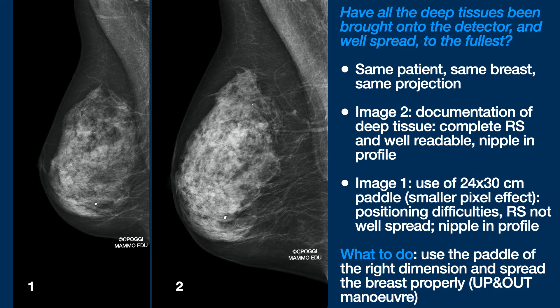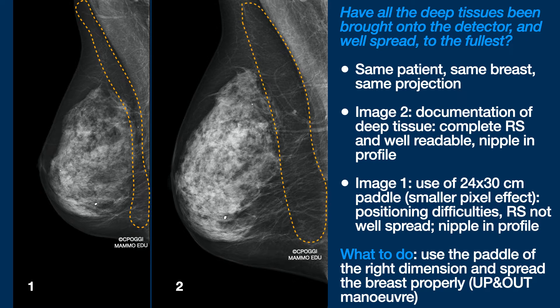Same patient, same projection. In both cases the retromammary space has been documented to the full. In the first one, however, using the larger paddle has created some trouble in positioning and in spreading of the deep tissue, which is not sufficient. There is a difference in size of the two breasts, due to the smaller pixel effect induced by the use of the bigger paddle. All this tissue is useless for diagnostic purposes and represents undue radiation exposure.